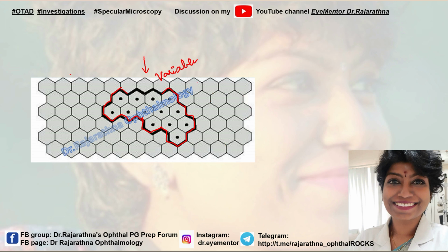Now if I go ahead checking only one field, so I check only one field, I use a bigger area and I mark it. Or, to get this area, I can use small frames but multiple areas. Do you understand? Let's say, for example, this is 1 square millimeter, because I'm not that great with numbers. To get 1 square millimeter, I can use one single frame, or I can use a 0.5 square millimeter and another 0.5 square millimeter, so that eventually I get 1 square millimeter area to calculate the endothelial cell density. Do you get that? So in variable frame, you have single field or multiple field.